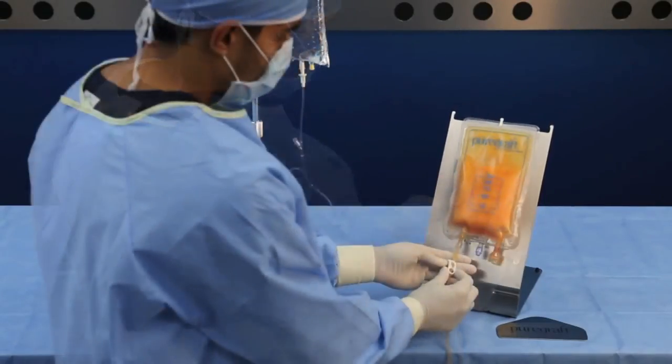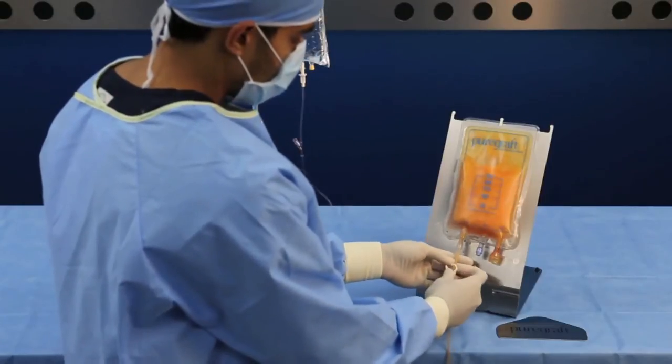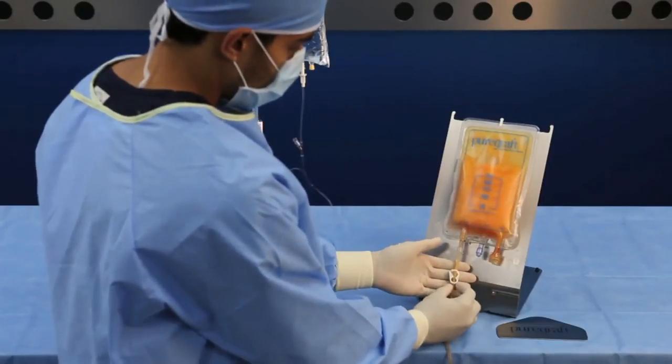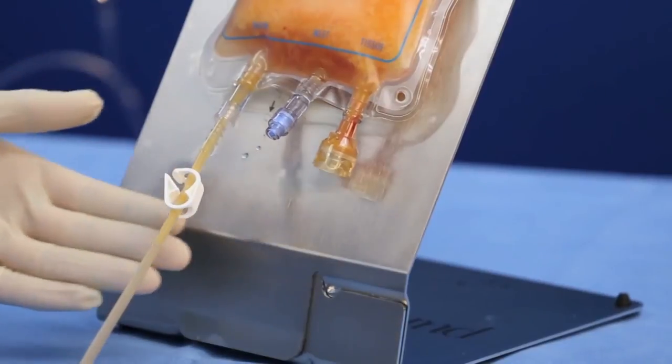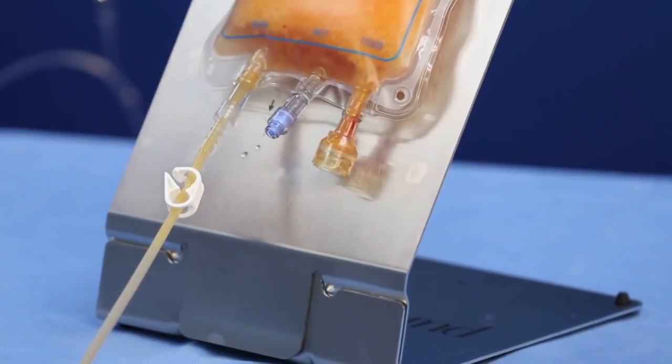Then open the clamp to the drain bag and drain excess rinse solution for approximately three minutes, depending on the preferred graft hydration level.